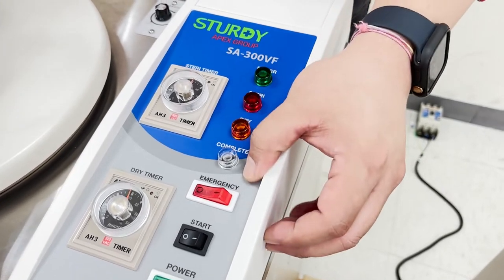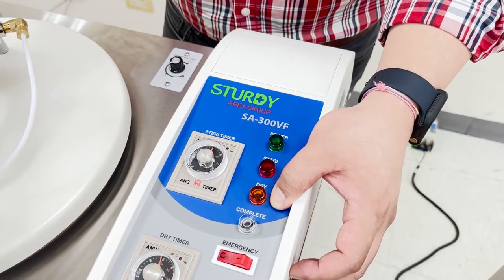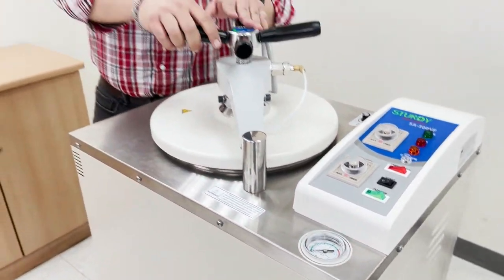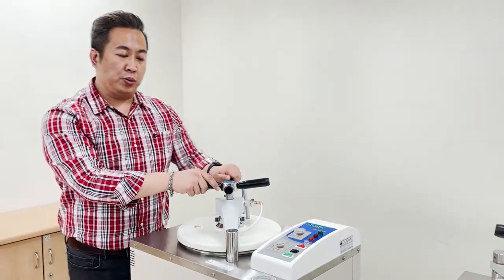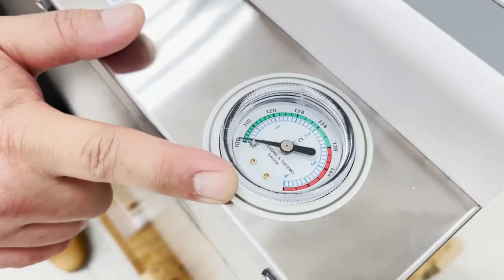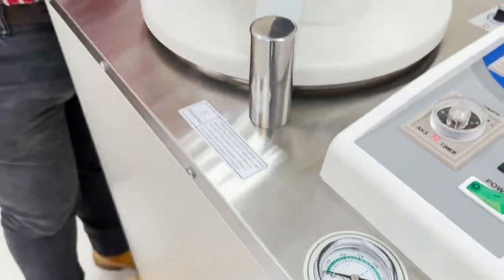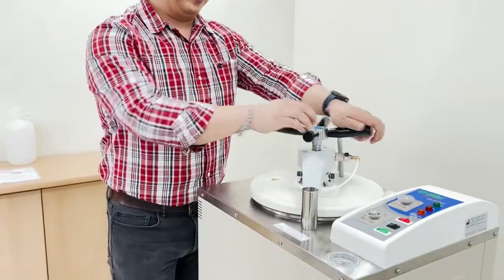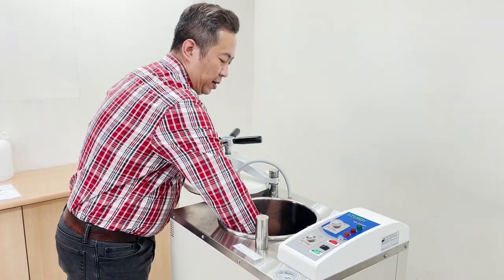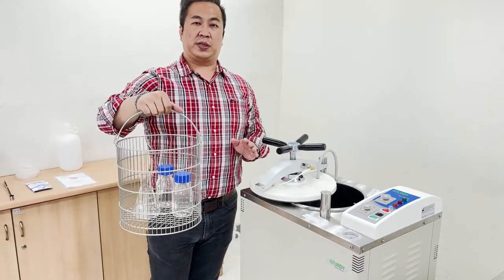Once the sterilization timer and dry timer have been set, simply press start. The indication lights will begin to illuminate: power switched on, sterilization begins, then dry mode, and finally completion mode. Once the sterilization process has ended, before opening the chamber door, ensure the mechanical analog indicating temperature and pressure has the indicator sitting at zero — that means it is safe to open the chamber door. Turn clockwise to open, then remove the basket containing the sterilized objects. Your sterilization process is complete.